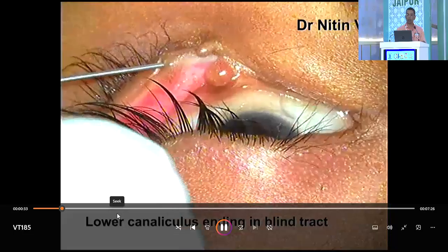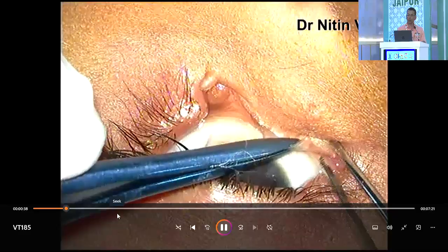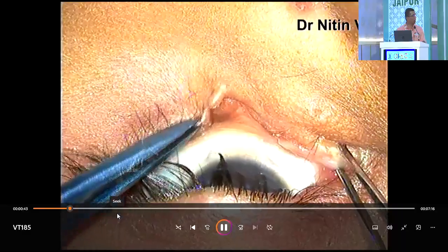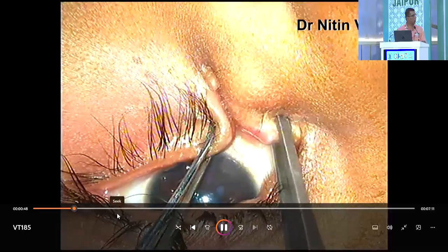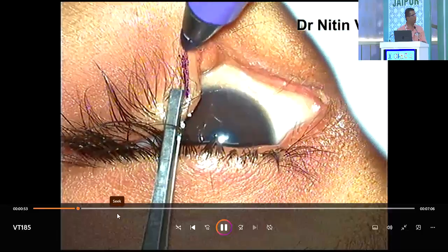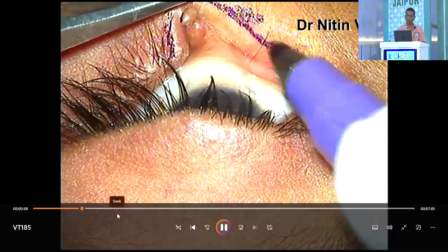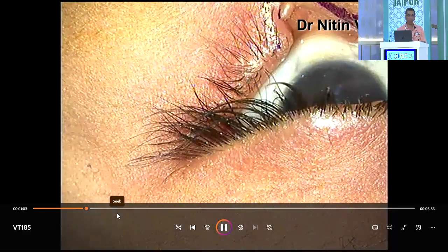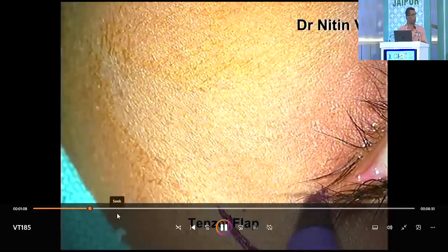Medial canthus was checked. In the lower lid coloboma, what is more important is to check how much is the defect, and whether you have either a medial or a lateral limb of fibrous tissue, the tarsal plate, where you can take the suture. It is not where the defect is ending, but where you are able to find the place where you can take the anchor suture. After identifying where the planned suture will be taken, the coloboma is excised and the raw areas are freshened up.